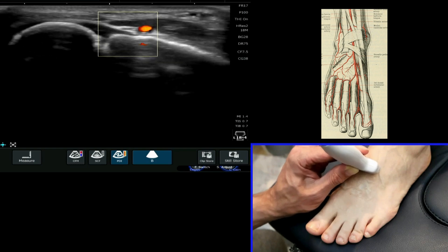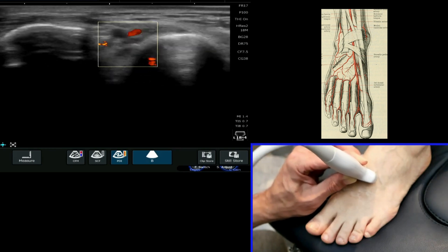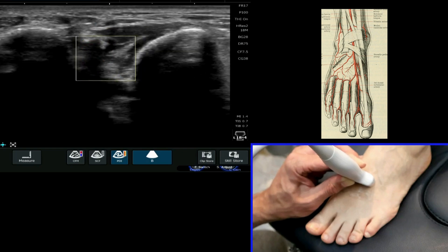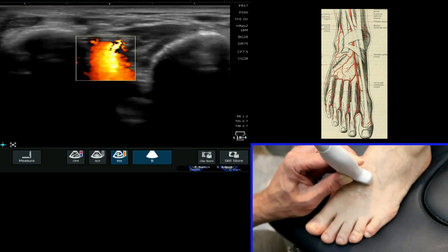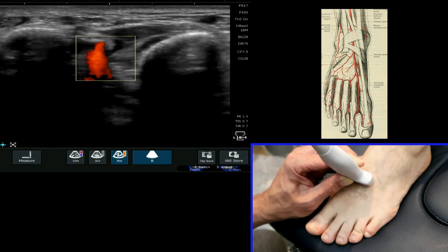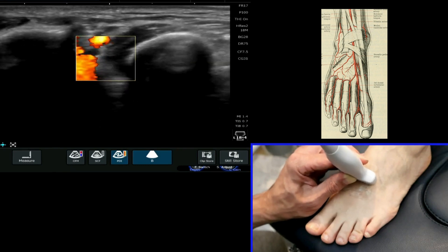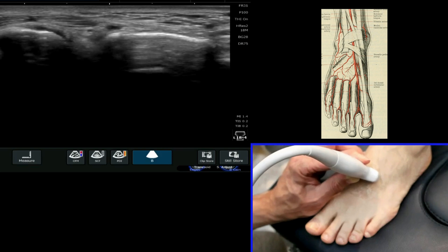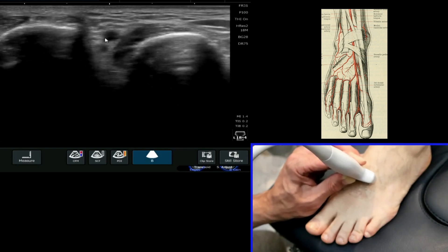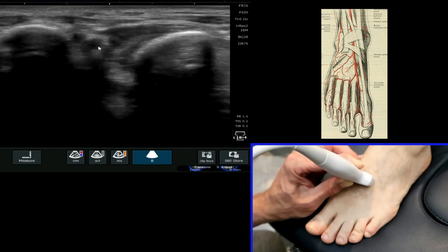As I then roll down more distally, you can see that it sits in between the first and the second quite clearly at that point. If I take my Doppler off, you can follow the grayscale appearances of it as I follow it. Here it is — it drops down into between the first and second.